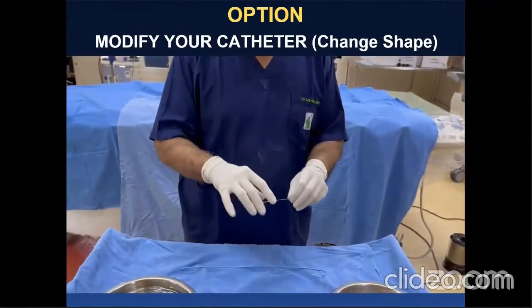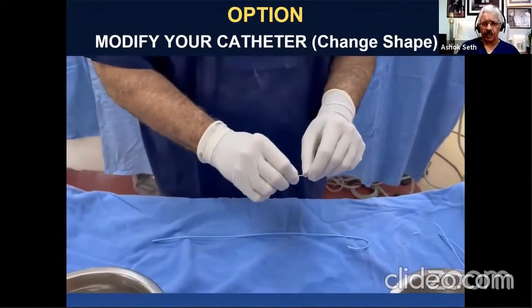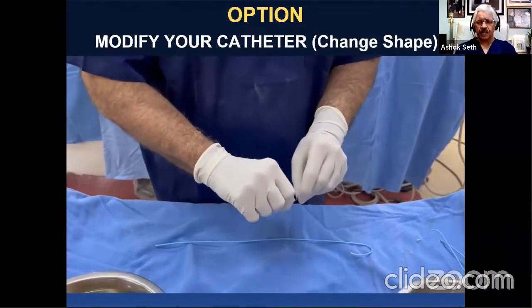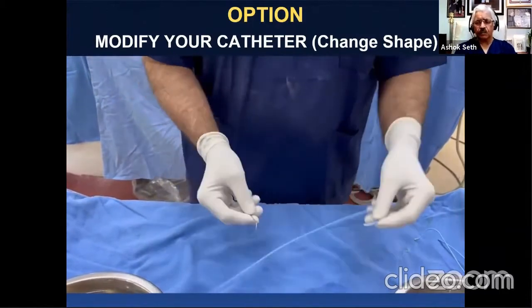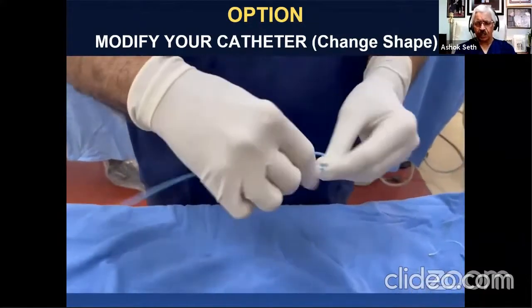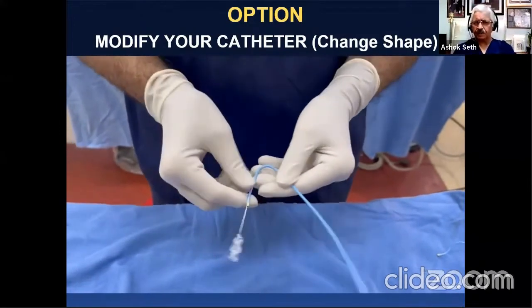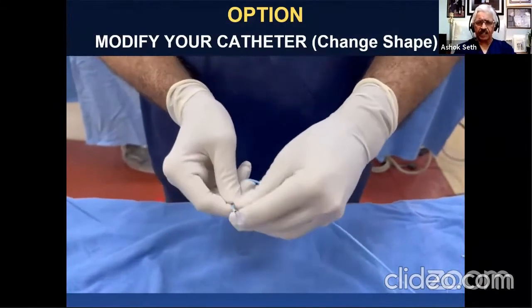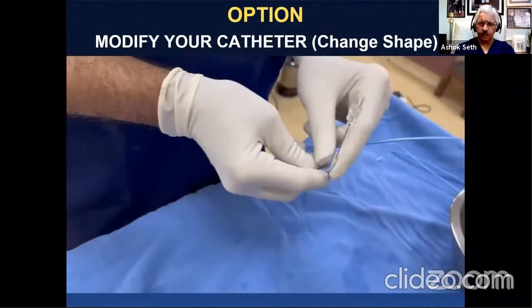Okay, then I'm going to relate this. I use the wire introducer as a mandrel, and I make a bend, which is what you see on the table, a Judkins left 7 French Judkins 3.5. And I introduce this wire introducer so that the curve I gave as the secondary curve now fits into the secondary curve of the guide catheter. And then I make a primary curve, which is at right angle anteriorly. That's how I'm bending this wire introducer.